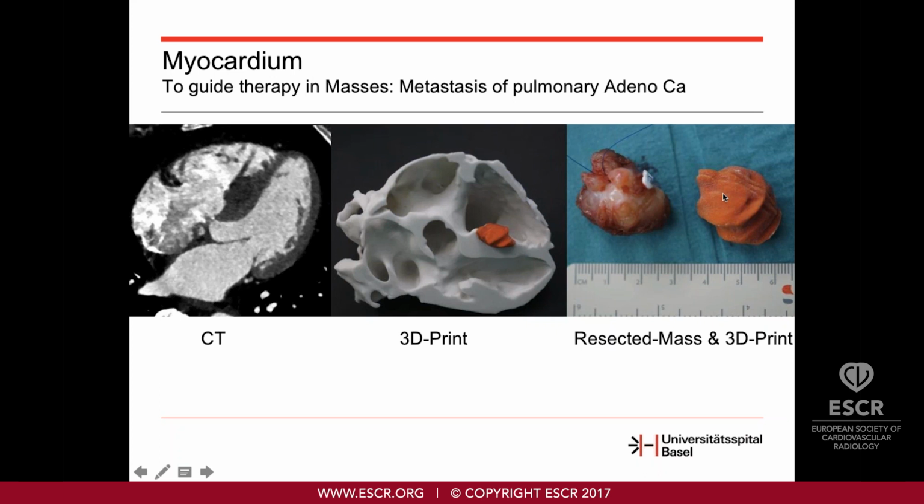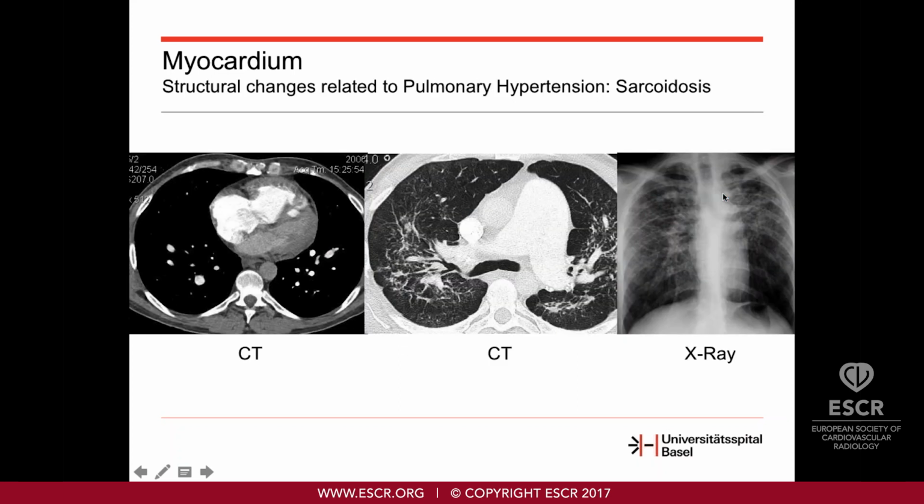With CT, we all know the Hounsfield scale, which helps us to describe the density of any tissue, myocardium. What's nice about the Hounsfield scale is that it's linear. So we have 2 points, water with a value of 0, and air with a value of -1000. So we have a linear relationship between the density of a tissue and the Hounsfield units. That's a very nice feature, and this helps us to categorize any tissue by doing some measurements. So the linearity is a very nice feature.